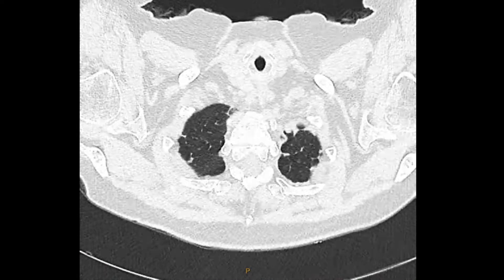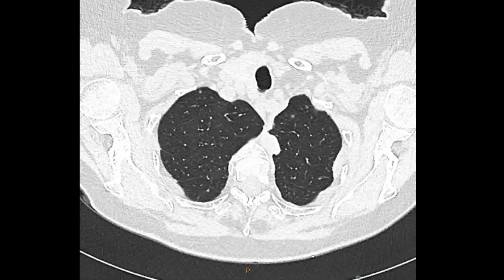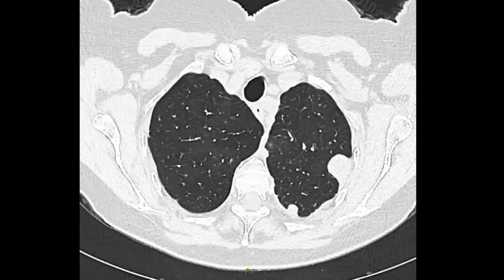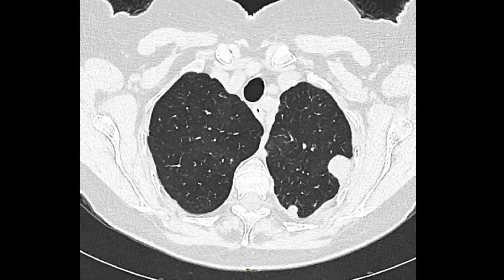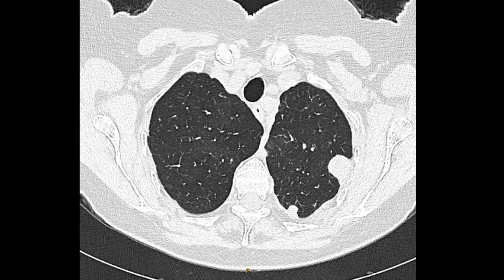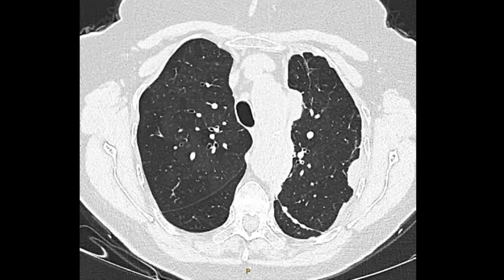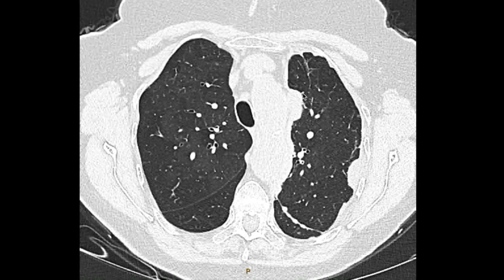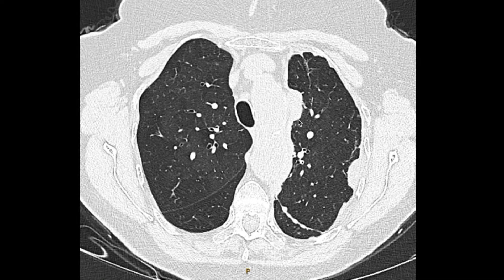This is the CT scan. We'll firstly have a look at the lung windows. Here you can see there's a lesion that seems to be associated with the pleura, and here's another lesion. The underlying lung looks pretty normal though. Let's continue to scan through — there's another bit of a lesion here. We may see this better on the mediastinal windows.